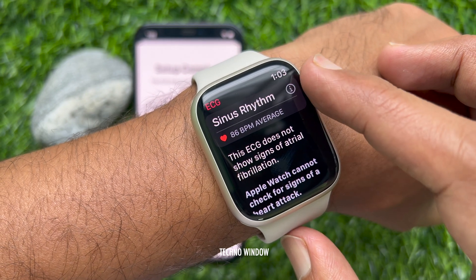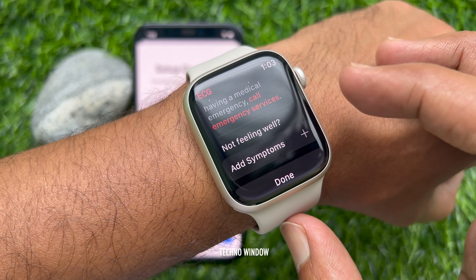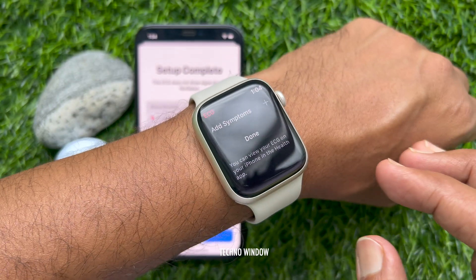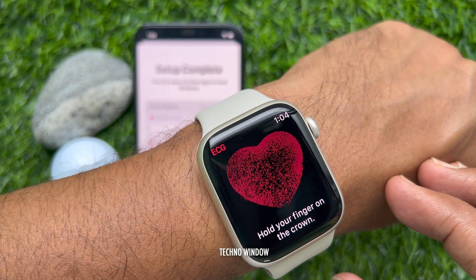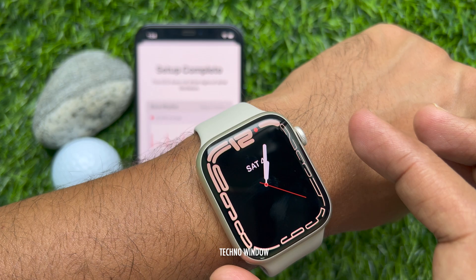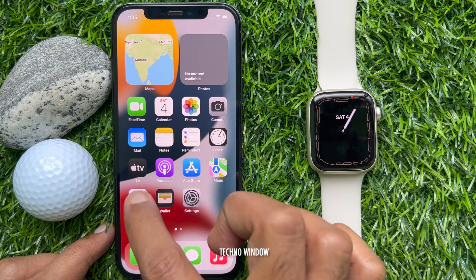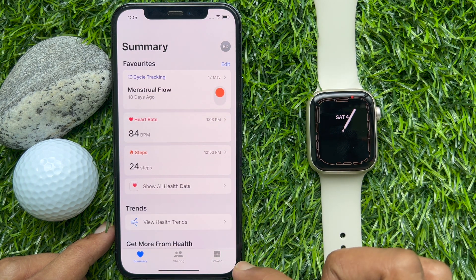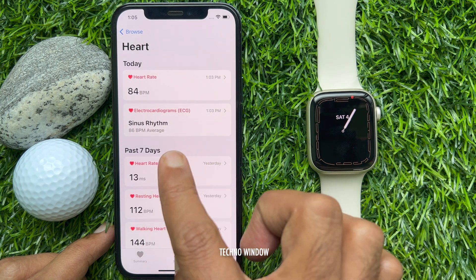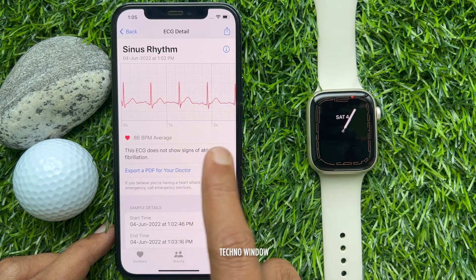Scroll and tap Done. From your iPhone you can check your ECG result. These are the steps to take an ECG with the ECG app on Apple Watch Series 7.